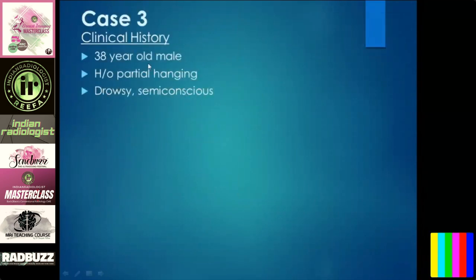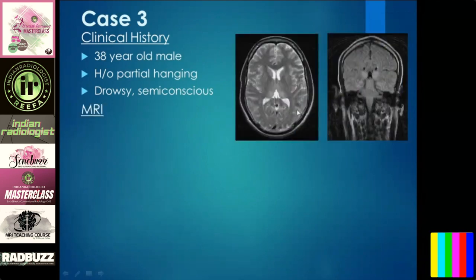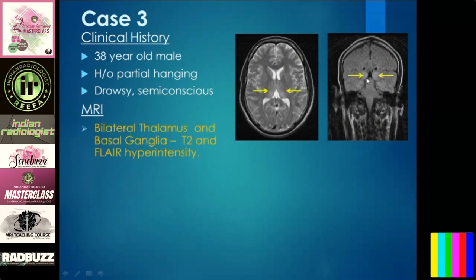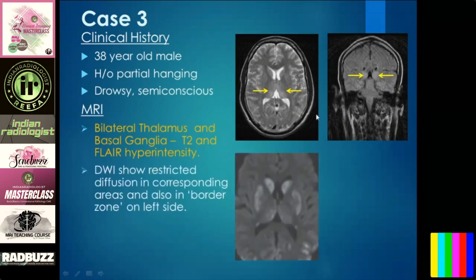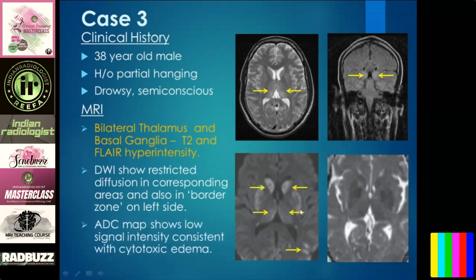Case three: 38-year-old with history of partial hanging, drowsy and semi-conscious. The moment you see this history, think of hypoxia. When thinking of hypoxia, always do a FLAIR coronal image. On MR, you see bilateral thalamic and basal ganglia FLAIR hyperintensities and diffusion-weighted restricted diffusion, also in some areas of the cortex. The ADC map shows low signal consistent with cytotoxic edema.